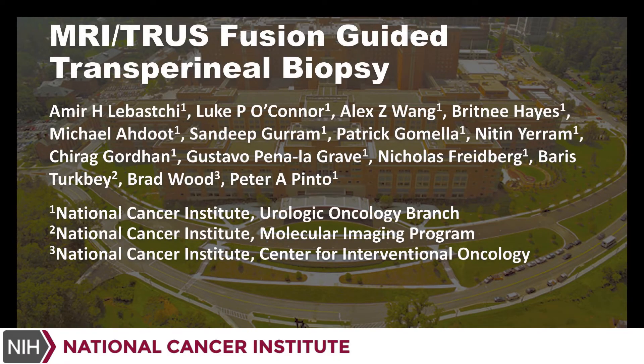In this video, we will demonstrate the use of the MRI Transrectal Ultrasound Fusion Guided Transperineal Biopsy utilizing the URONAV platform.